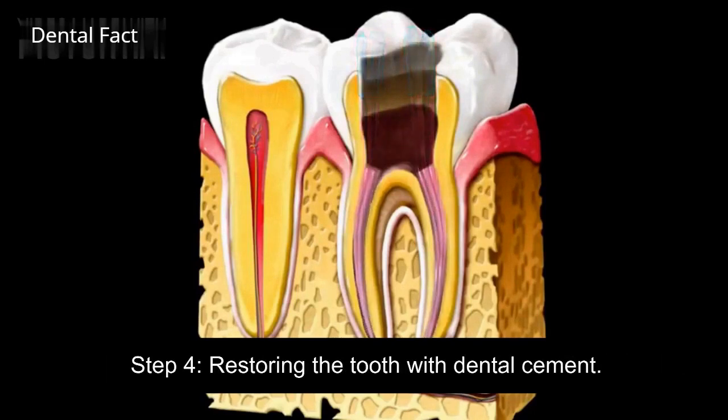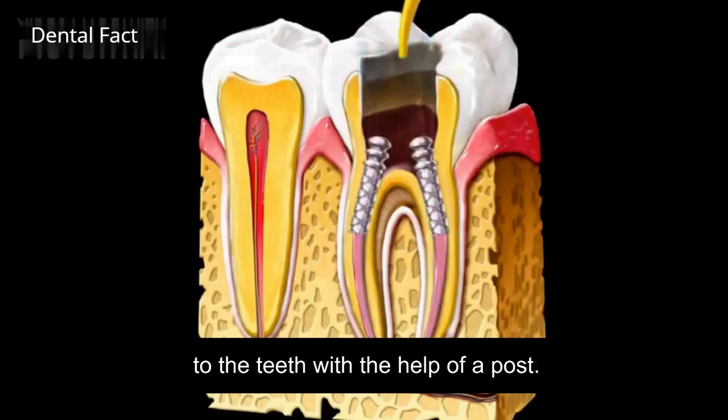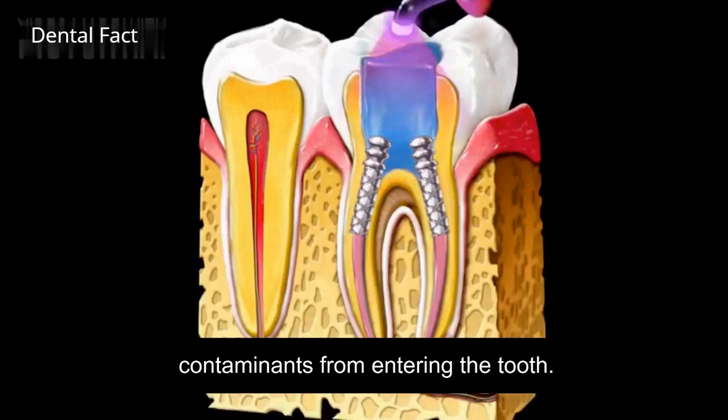Restoring the tooth with dental cement. If needed, your dentist may also place extra support to the teeth with the help of a post. There are a wide range of dental cements. The dental cements prevent any contaminants from entering the tooth.